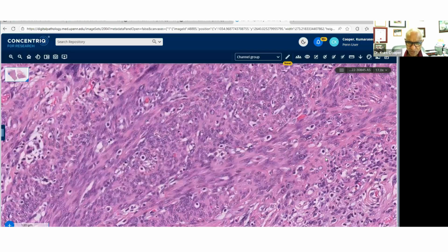If it's not Mullerian, then, well, I think it is of Mullerian origin, Maria. I think this is extrauterine adenomyoma occurring in the abdominal wall, like you would get endometriosis occurring in the abdominal wall. I do not know the pathways of how this occurs, but I was happy that it has been described in the literature, and I was able to Google it and found at least 2 papers talking about the same thing.